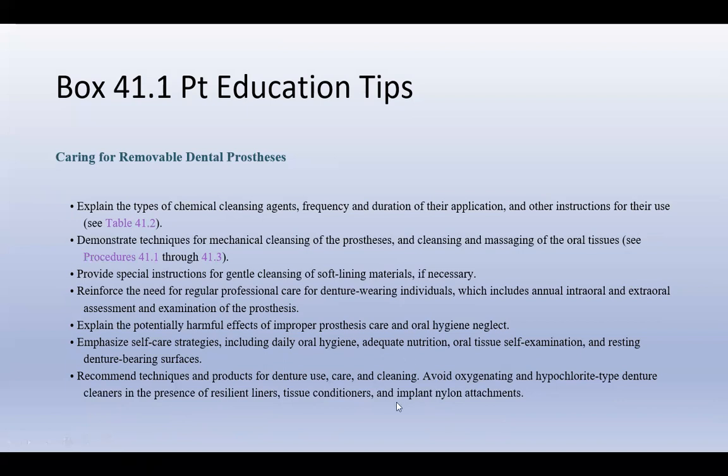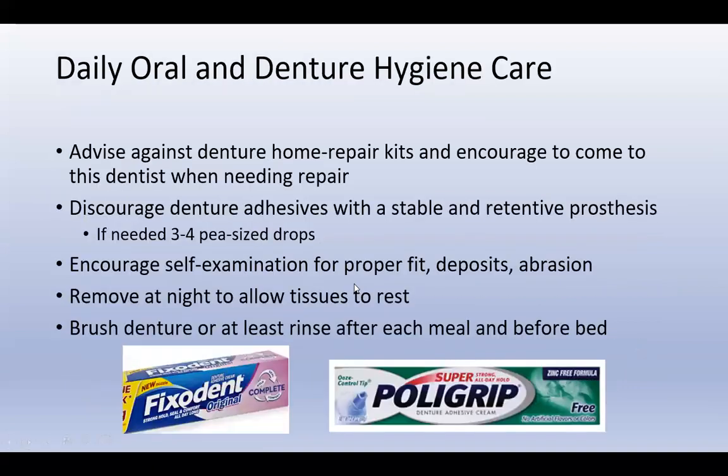Tissue conditioners and implant nylon attachments, so the little gaskets, I call them little rubber gaskets. Anything that's too much of a harsh cleanser can damage those parts. Daily oral and denture hygiene care. Advise against denture home repair kits. Encourage them to have it professionally relined at a dentist.